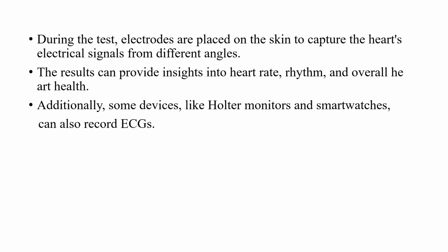During the test, electrodes are placed on the skin to capture the heart signals from different angles. The result can provide insight into heart rate, rhythm, and overall heart health. Additionally, by using the ECG record, some devices may be used like Holter and smart watches.